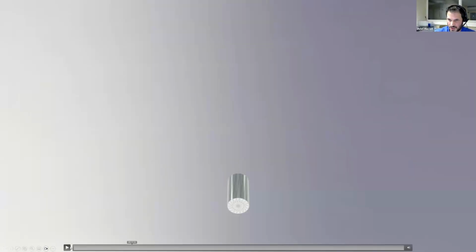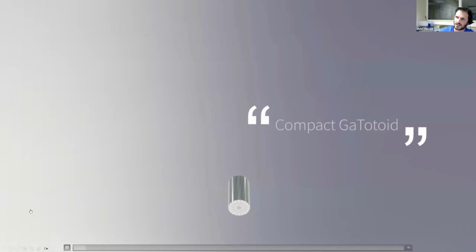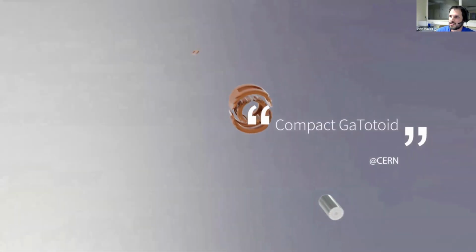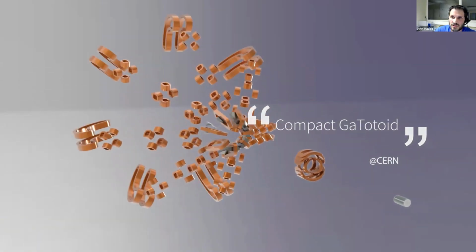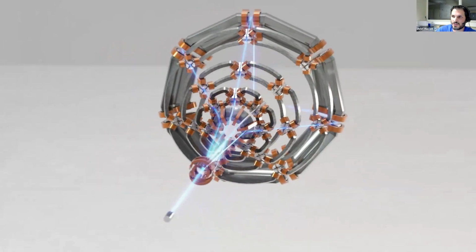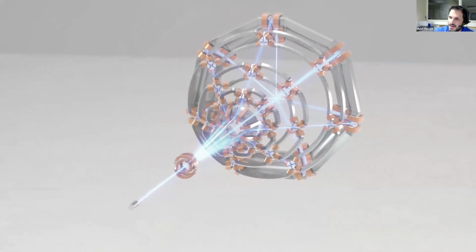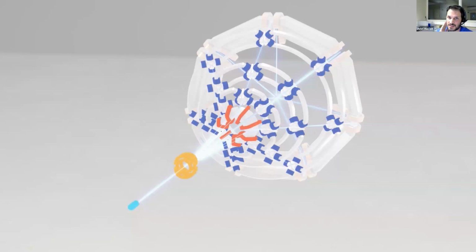And to finish on the gantry, I would like to show you this video showing what could be a treatment using the high energy electron design. So you can see here on the video the different parts of the gantry system. It includes basically the beam coming from the accelerator, the vector magnet, then the first septum that is amplifying the angle, 3 quadrupoles, and the main bending magnets.